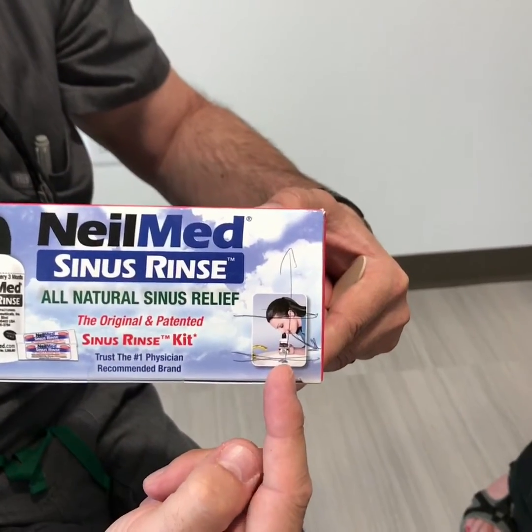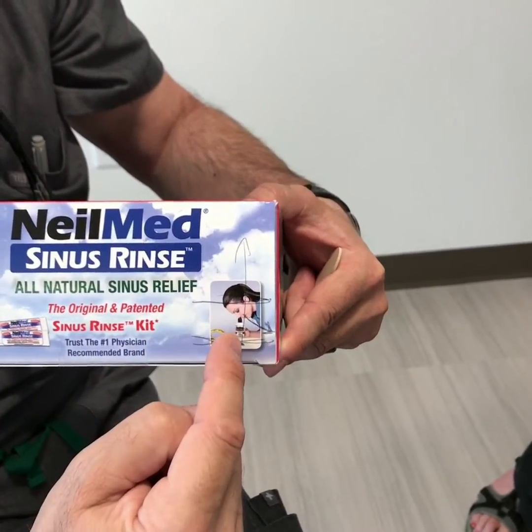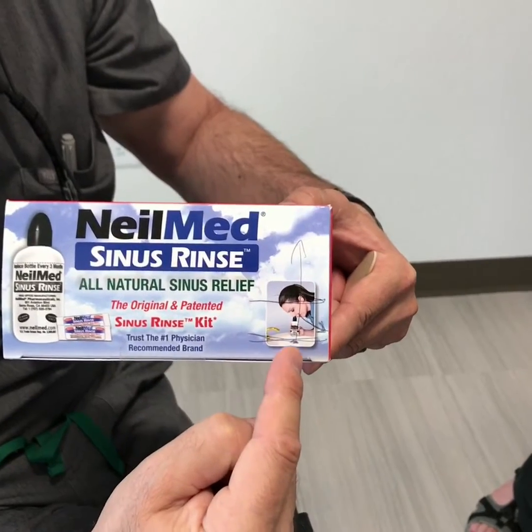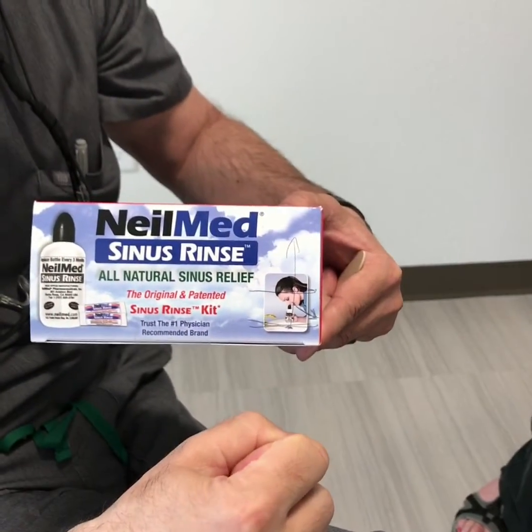Number two, the bottle should be directed directly up, going perpendicular to the orientation of your head. So it will enter one nostril and gravity will take it down the other nostril. And three, you need to be exhaling out your mouth while you're squirting in through your nose.